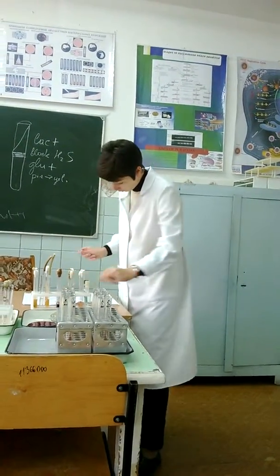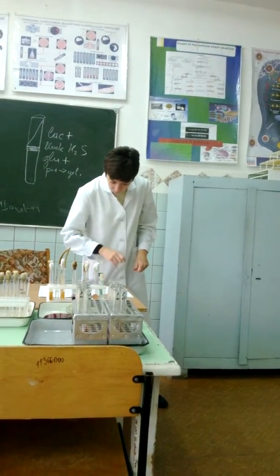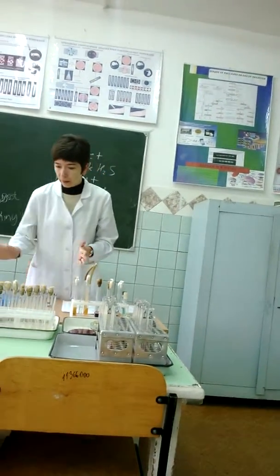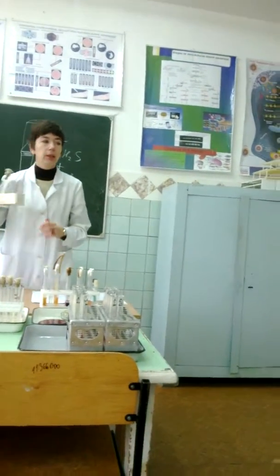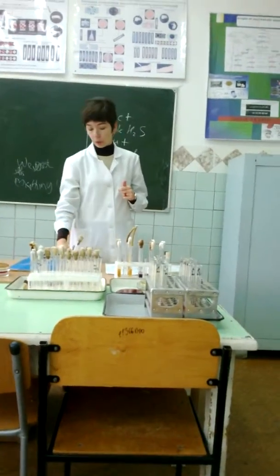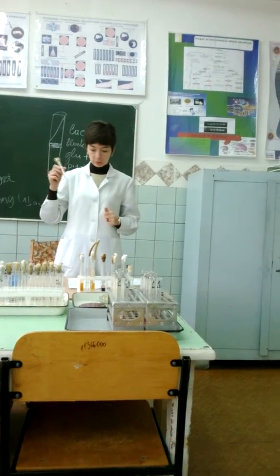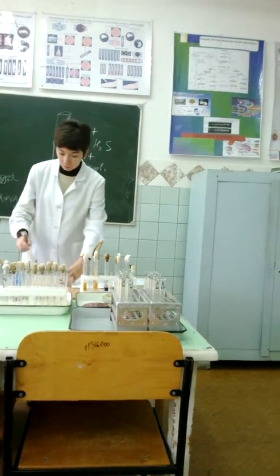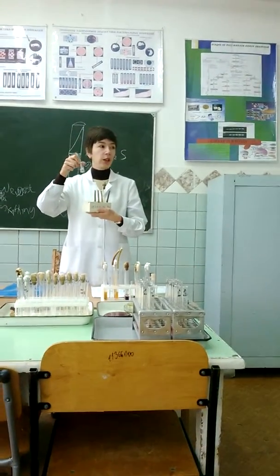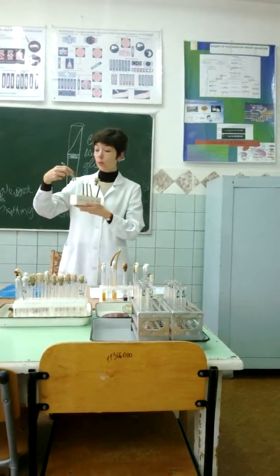The next test. Slide agglutination test. It's also a test for detection of antigens of bacteria, for identification of bacteria. We take bacteria and take monovalent serum to antigens. An example is identification of Salmonella.